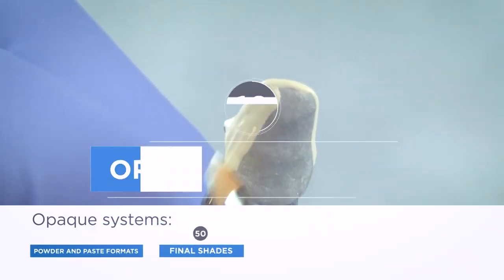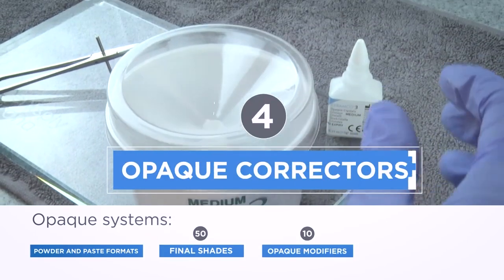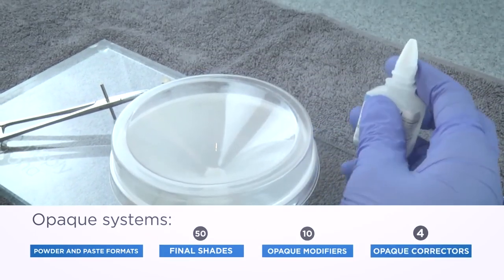In our video series, you'll see how Ceramco 3 is an ideal veneer system for any lab tech at any level of proficiency.